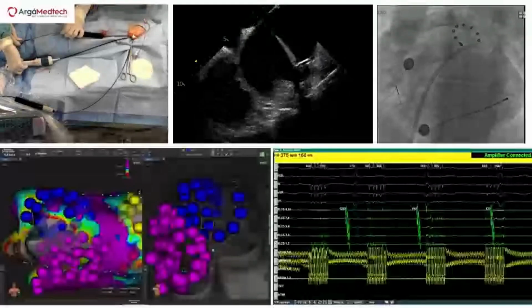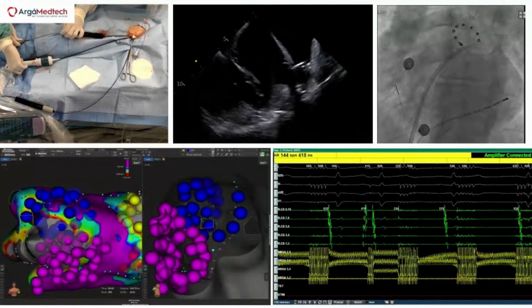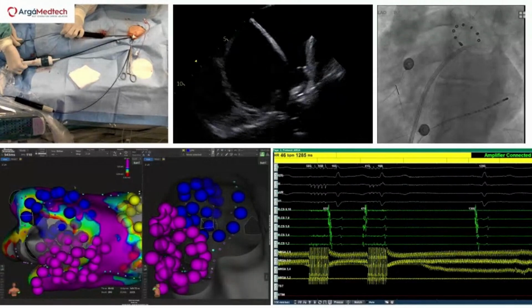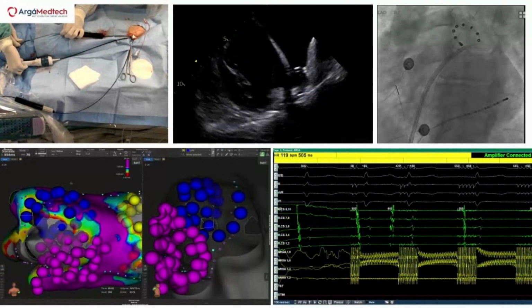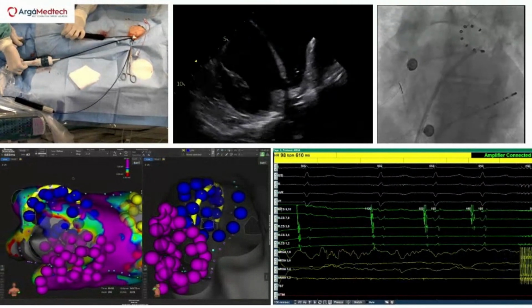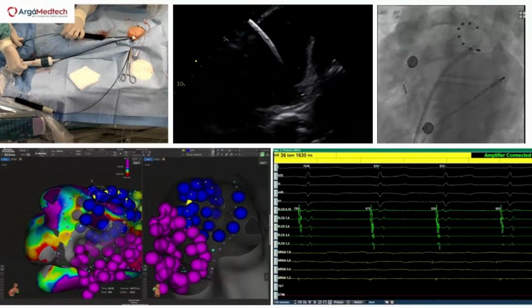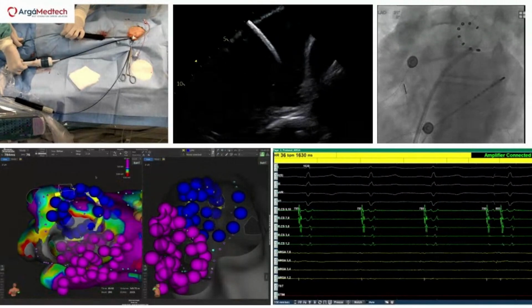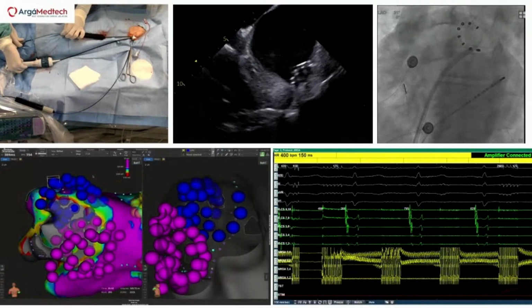So now we can light up. Ante, can you light up the impedance proximity index? But also the console engineer, the generator engineer, can show you post-ablation the quality of the contact based, obviously, on the impedance. I'm rotating counterclockwise now. Good. So this is superior, posterior, inferior for the left superior pulse 4. Go.